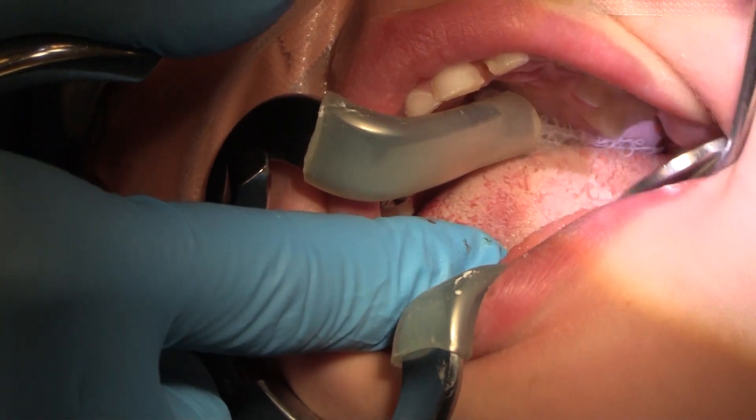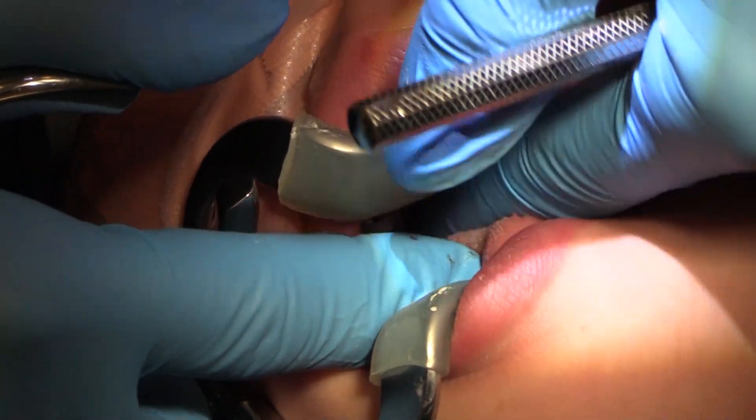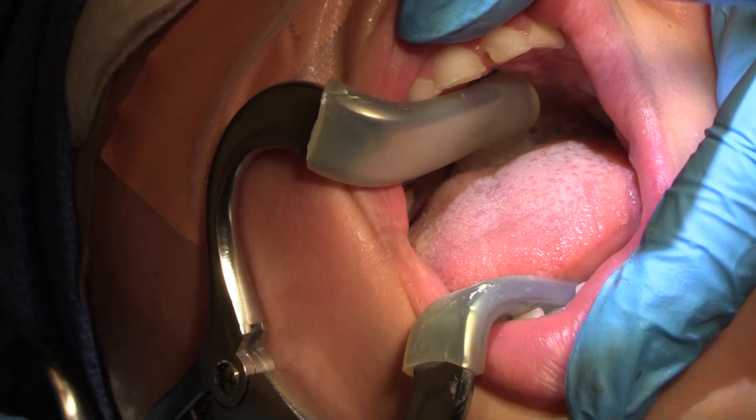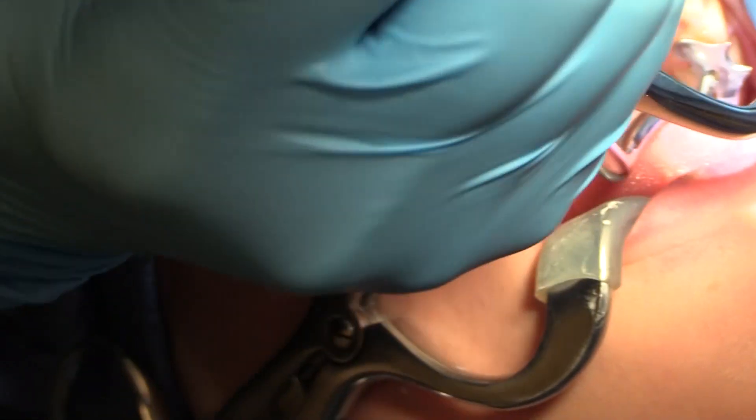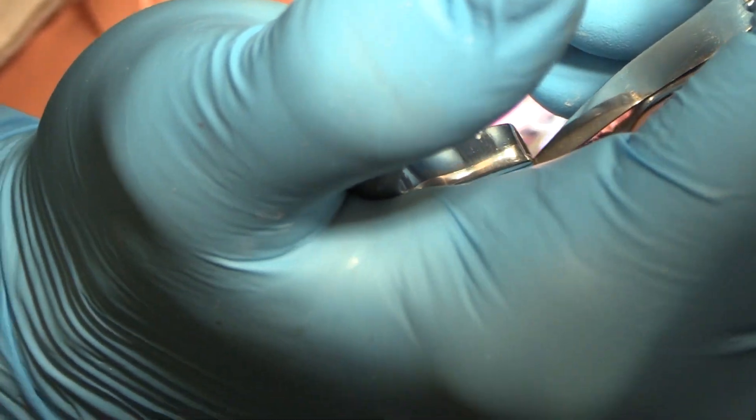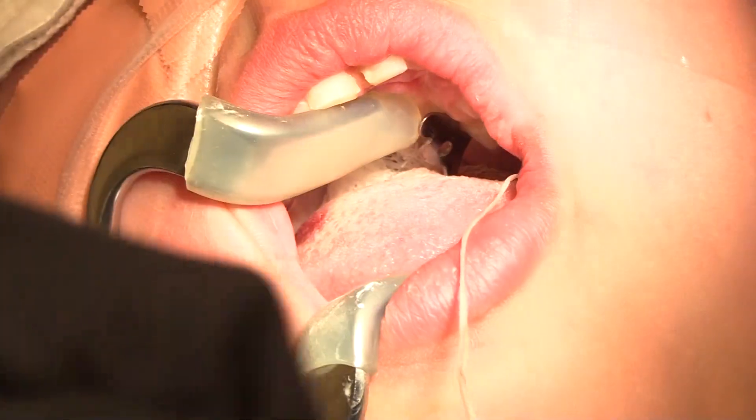Rubber dam is going to go on and I'm just going to push our little throat pack a little bit. If you're not using a rubber dam, you absolutely should — it's going to make your life so much easier. And it really takes literally a few seconds to get it on.